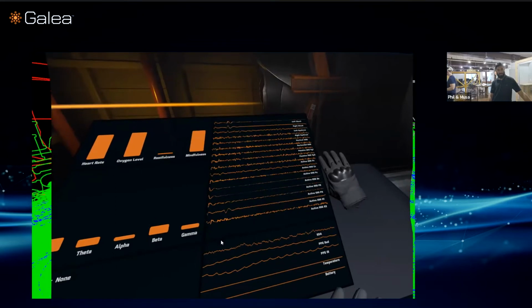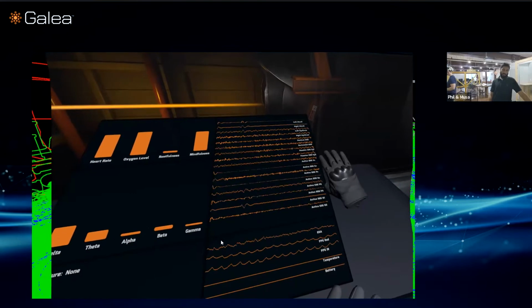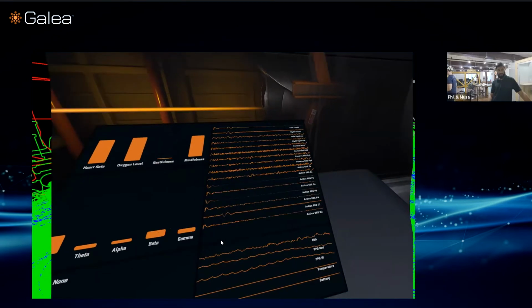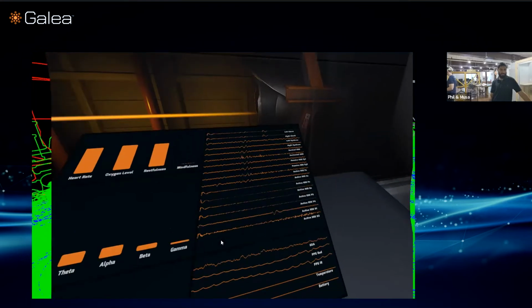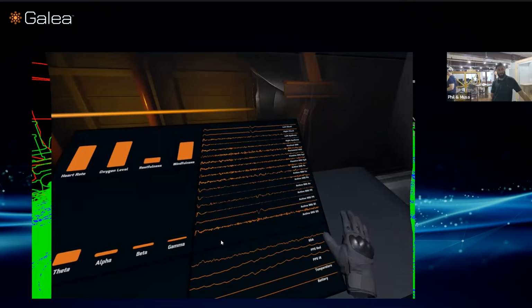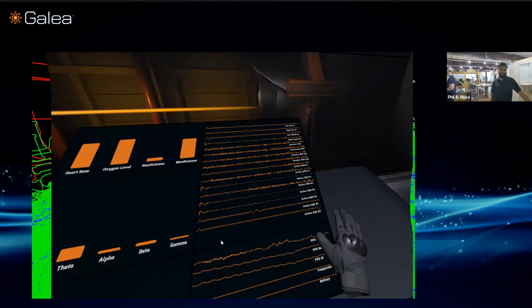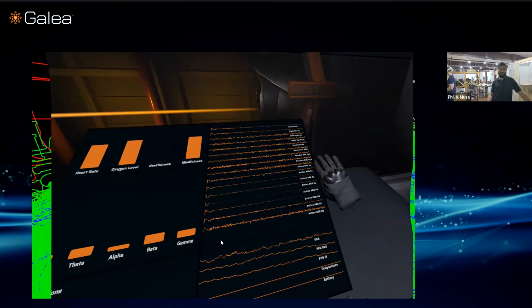So the frontal lobe of the brain is what regulates executive function, like planning and thoughts. And the reason that it is using passive electrodes is because it's on a bare skin region. There's no hair in that region. And if you've worked with EEG before, you know that getting data from hairy skin regions is quite difficult because you need to get good electrode contact and you need to minimize skin electrode impedances.